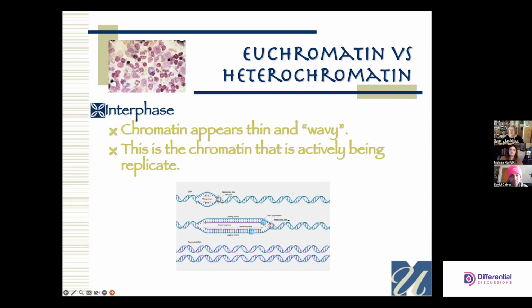So they never really get a lot of heterochromatin. They stay in this wavy euchromatin state. But most of the time we see them in the bloodstream, and even to a certain degree when they're out in the tissues. They will stay that way for maybe a day or two before they commit to whatever it is that they're doing. And then the heterochromatin will come in.